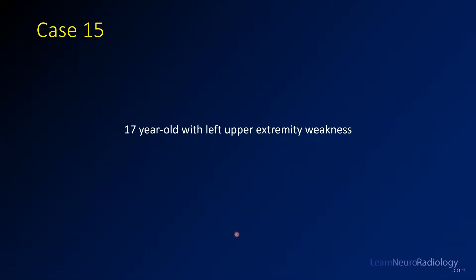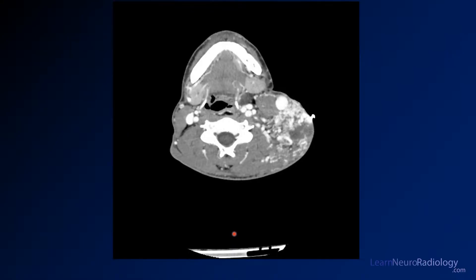Case 15 is a 17-year-old with left upper extremity weakness. Here we have some images from a CT angiogram. You see this arterial phase here. This bright thing right here is just a palpable abnormality marker, so the patient has an abnormality that they can feel there.